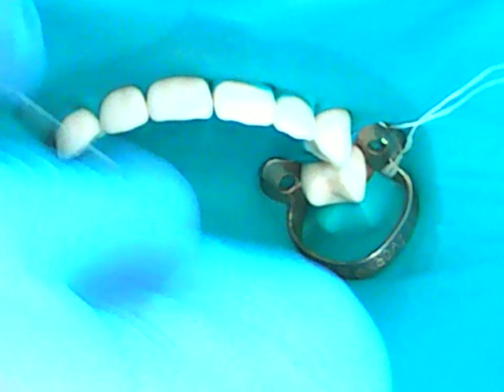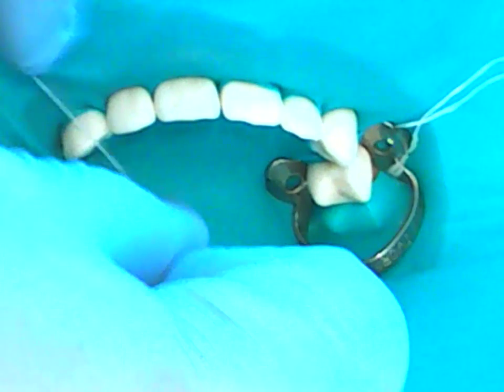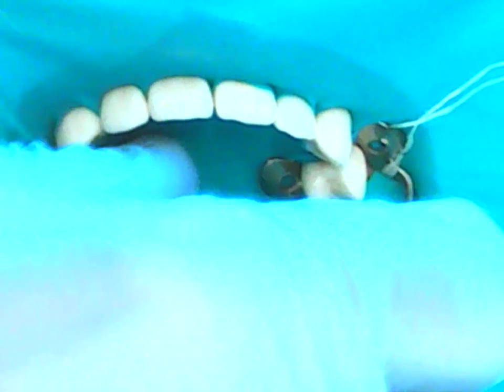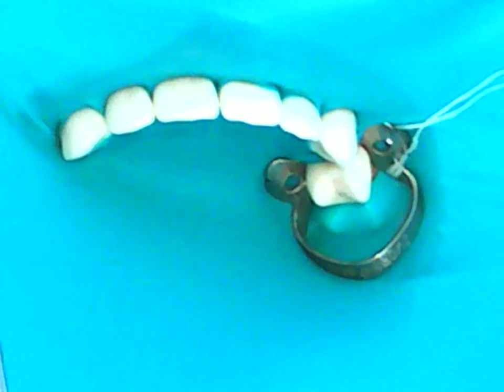This is my open contact area. Did you see how that just came back up? I didn't go without the embrasure space, so I had it inverted and it just relapsed to where I had it before. Okay, and then the last one.